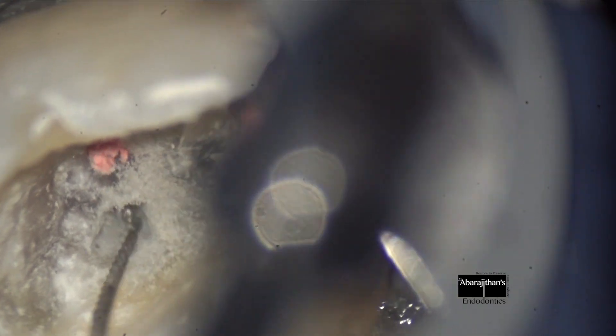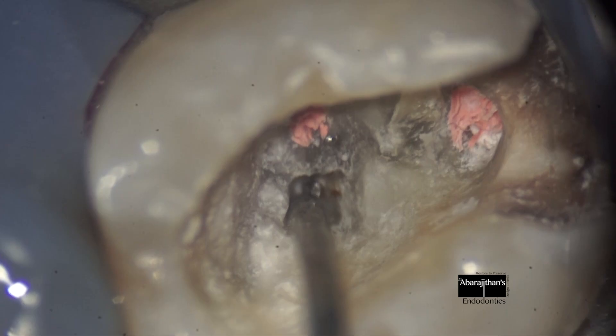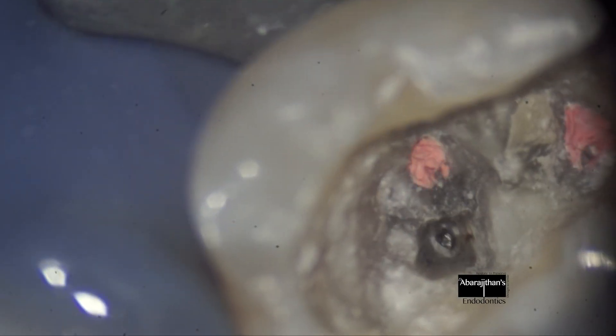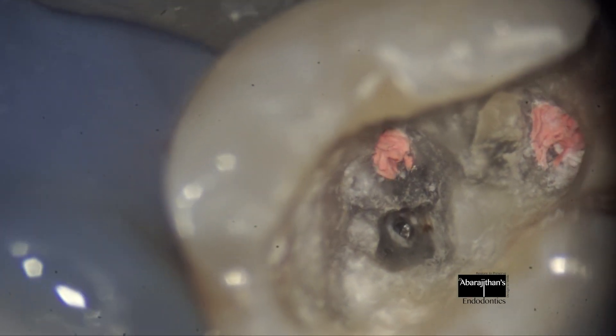This is done with U files in a dry mode. Once we are able to achieve two millimeters of instrument exposure, I start to check if the instrument has loosened in the canal with the help of a DG-16.